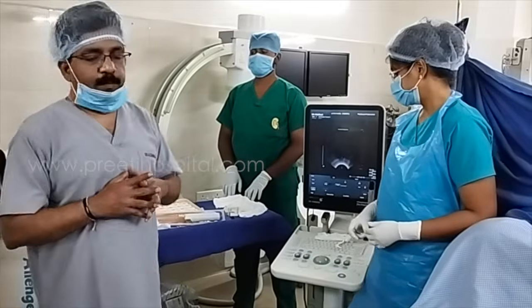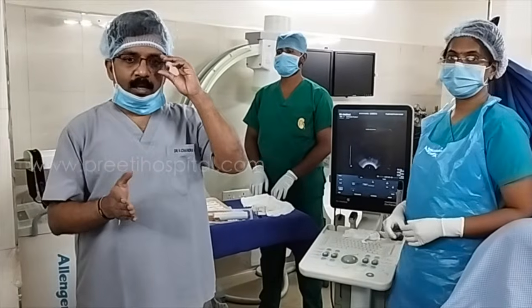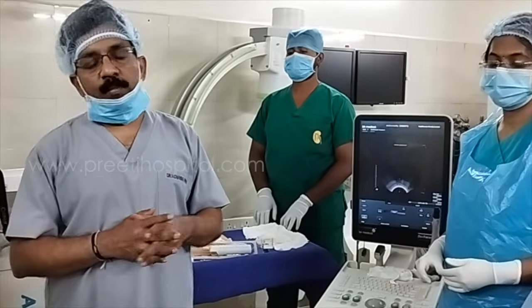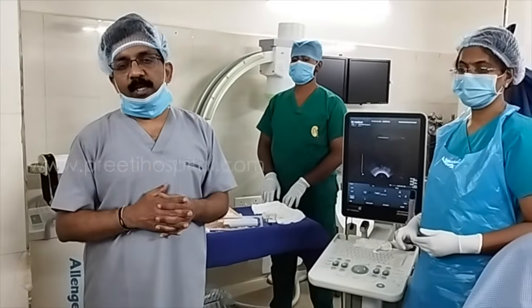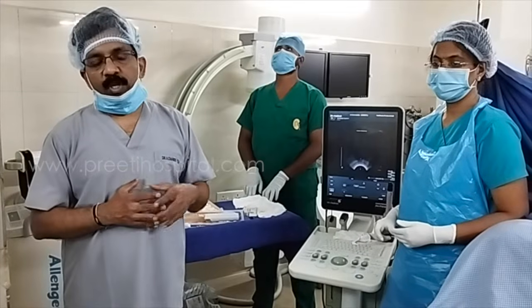After we have taken the BK ultrasound, we could do biplanar visualization and take the biopsy predominantly in the sagittal plane. Previously, when we had the Philips ultrasound, we used to do the axial cuts. The important difference we are understanding is that sagittal cuts are very important because they take most of the periphery. With that intent, we are sharing.